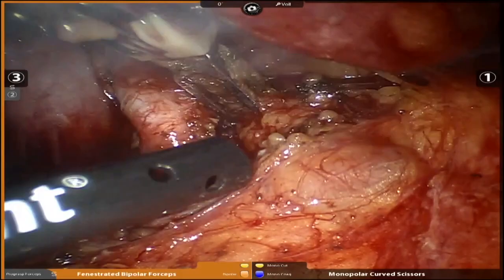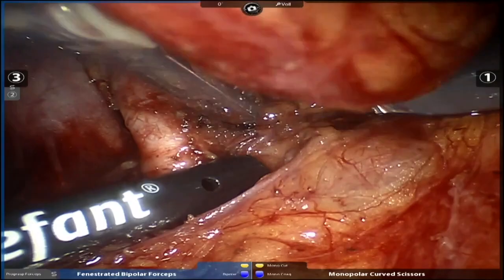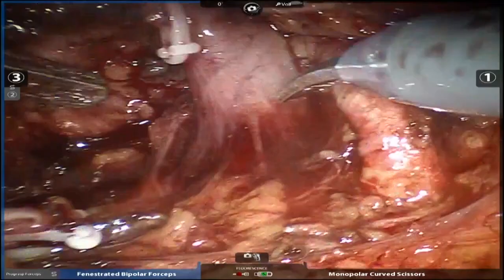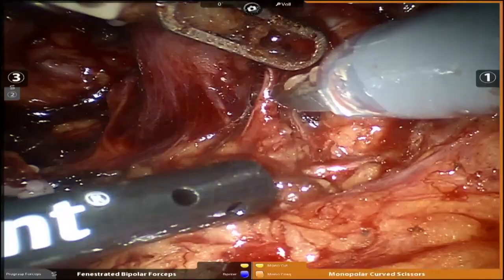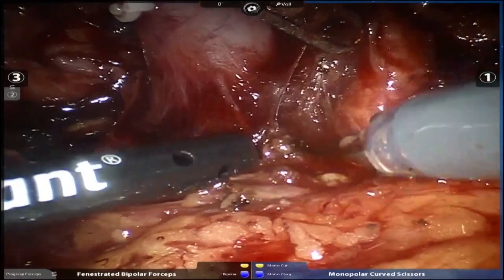And this dissection can be done. It's not a problem. We're just going to take our time. But then you start thinking about things like, well, what else could that be? Suck right here, please, Brando. Let's find the aorta right here. Let me just make sure I know where that lumbar clip was, which is right there. Okay, good. So right here. I mean, it always could be a segmental artery just making a turn. They sometimes really go some crazy directions. And the more you dissect, the more I think this is a segmental.